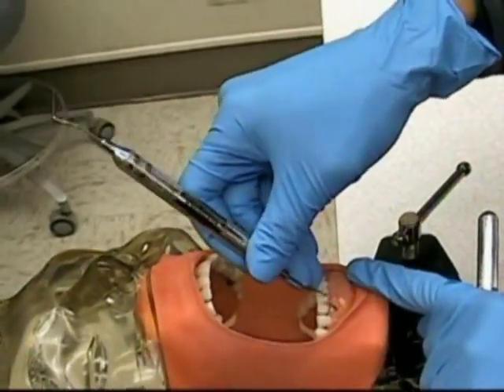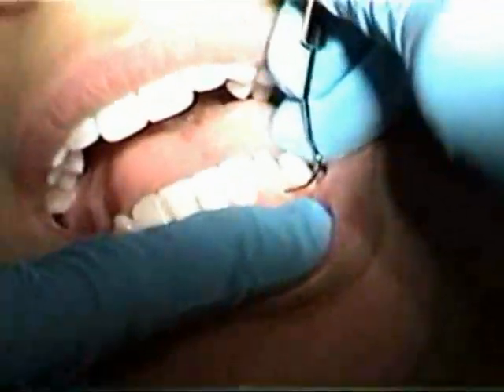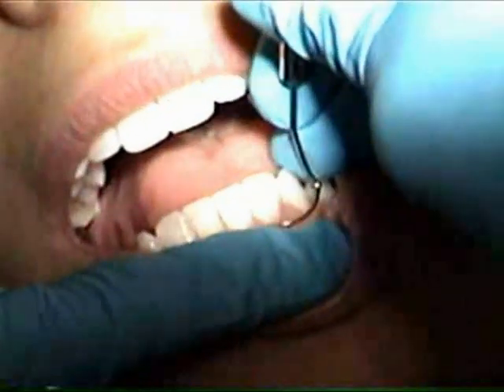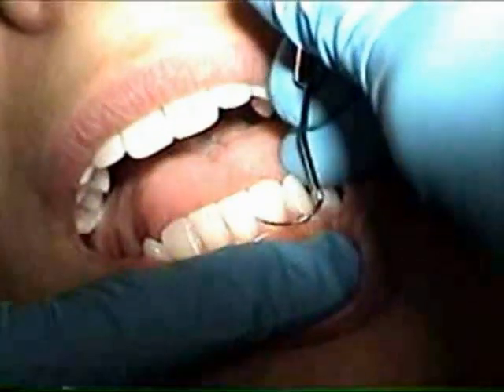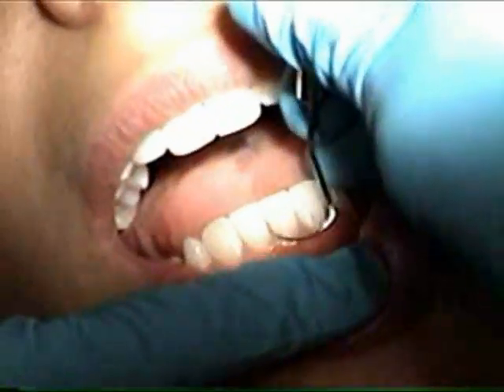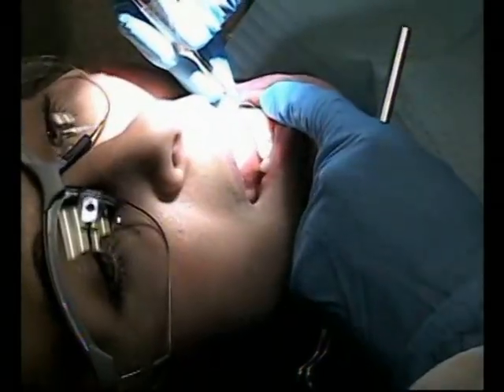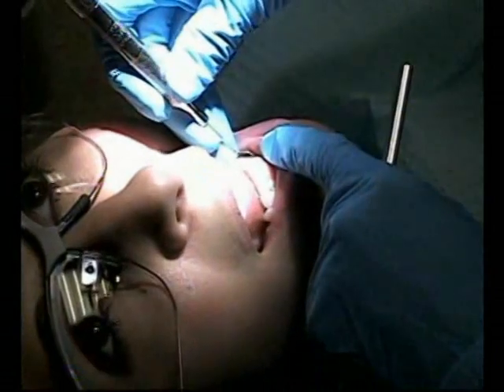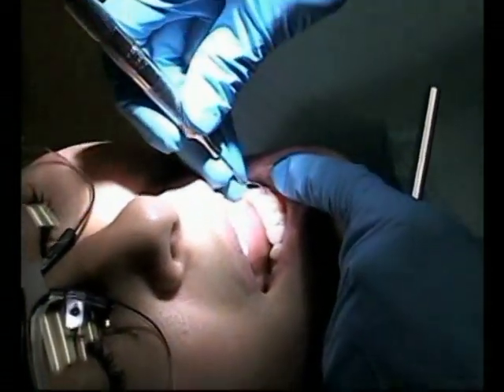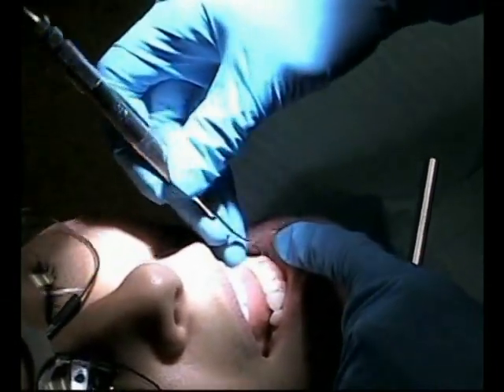But this is great, you know, when I look up, I can see it. Anterior surfaces towards you. Start at the midline of the tooth and rock. Roll as you approach the interproximal.